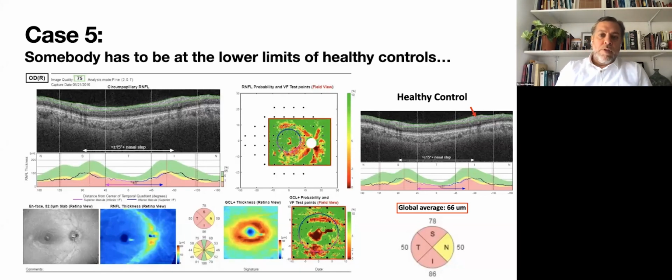but when we do a visual field test on this patient, it looks normal. Also, an important piece of data is in these arrow points, where the blood vessels are located. When you have normal tissue, the blood vessels won't pop up. When you have less tissue there due to glaucoma, the blood vessels will pop up a little bit more. That's an interesting biomarker to look at on the RNFL when you have these doubts.